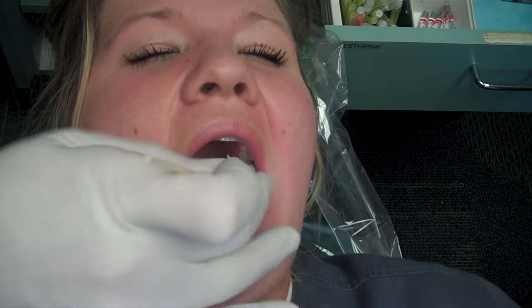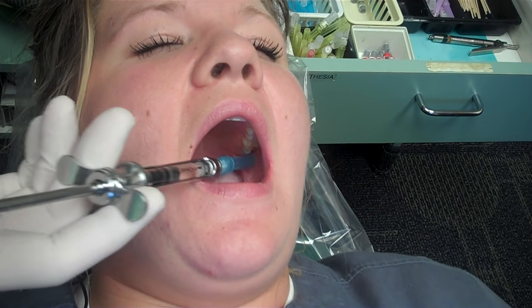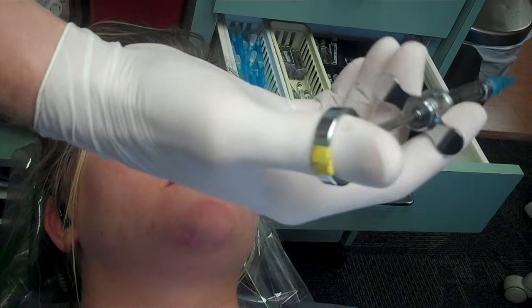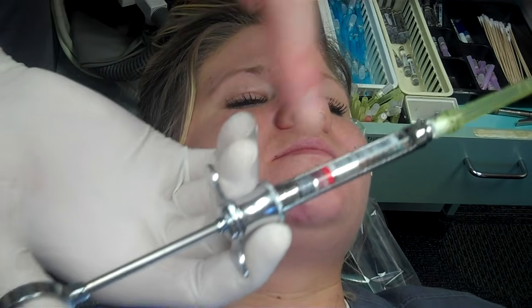Okay? So if I'm truly giving April a block, what I would end up doing is I would go in here, I would take this off, and I would give her injection, first one right here, with the plain and the blue. Now guess what? I screwed up. Why did I screw up? See, that's loose. That would be bad. I would be very mad. So remember, that has to be set there so that there's no give, because when we go in there we have to pull back to make sure we're not in the blood vessel. So she would get that for the block, and then immediately following we would do the same thing right back there, that 27 gauge and lidocaine, to give the full block without stinging.